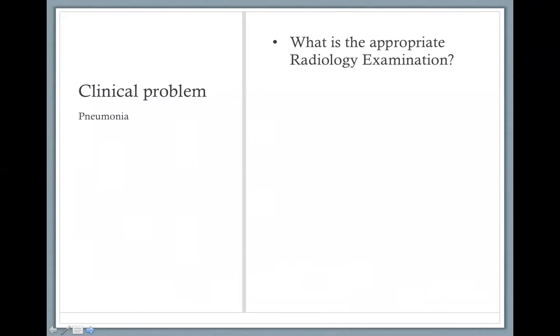I'm going to take you now through very quick clinical scenarios. Some of them we have gone through, but just to get the idea of what the word appropriate means, because we talked about this before the break, but I wanted to take you through the terminology and maybe quickly compare different imaging modalities for different structures. Because I thought there might be an area of confusion there, so I wanted to clarify.